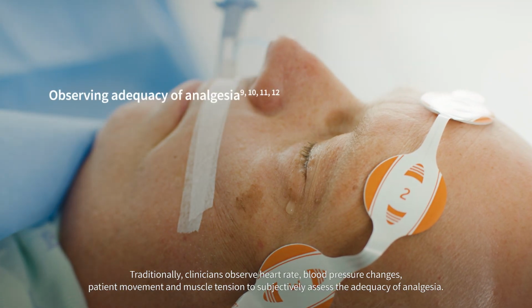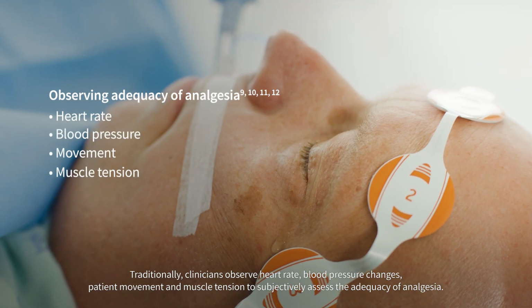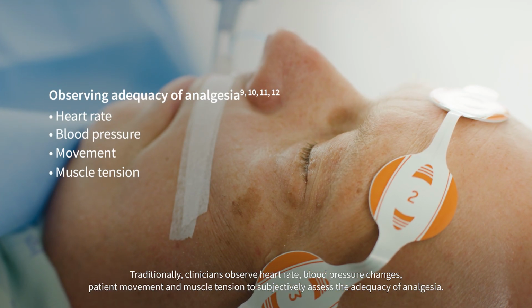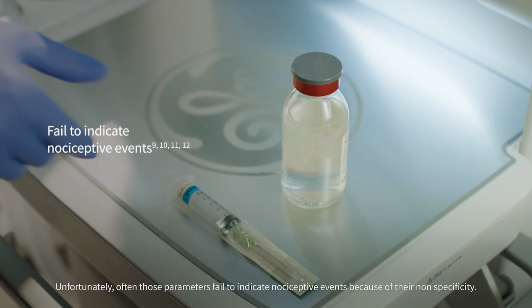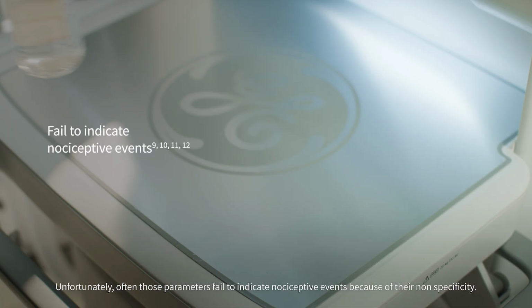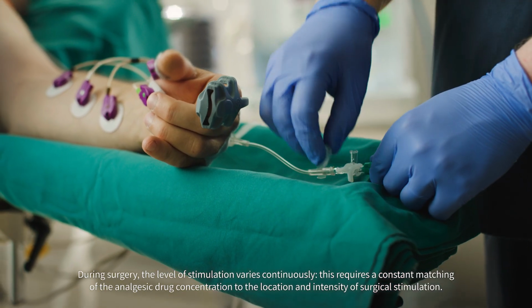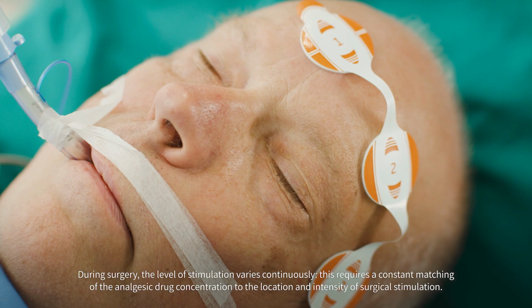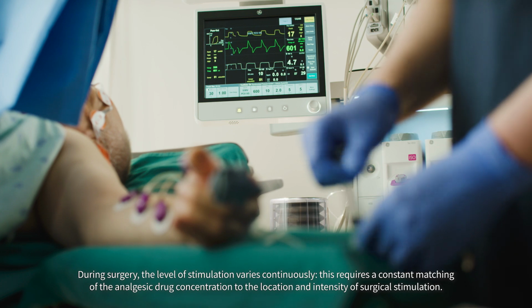Traditionally, clinicians observe heart rate, blood pressure changes, patient movement, and muscle tension to subjectively assess adequacy of analgesia. Unfortunately, often those parameters fail to indicate nociceptive events because of their non-specificity. During surgery, the level of stimulation varies continuously. This requires a constant matching of the analgesic drug concentration to the location and intensity of surgical stimulation.